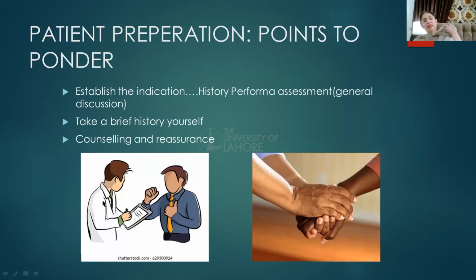So to start off with the history. In our department, the history proforma is usually filled by the resident. It is my view, and of paramount importance, that before starting an investigation, the indication of that investigation should be established in the history proforma. And I urge the technicians, since I'm focusing my attention on them here, that before starting the procedure, they should be clear in mind what type of questions the physician has in mind, that is, what is the indication of the study.